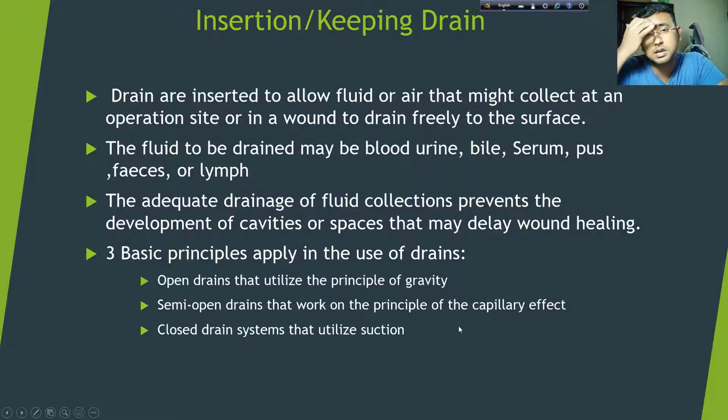If there is an infected wound like a bed sore, infection from a burst appendix, wound dehiscence, or any infectious subcutaneous hematoma or abscess, in that case abscess drainage occurs, and there may be a vac dressing or vacuum assisted dressing, which is called the closed drainage system, which will be placed here with a drain. In that case, that will be used for suction.